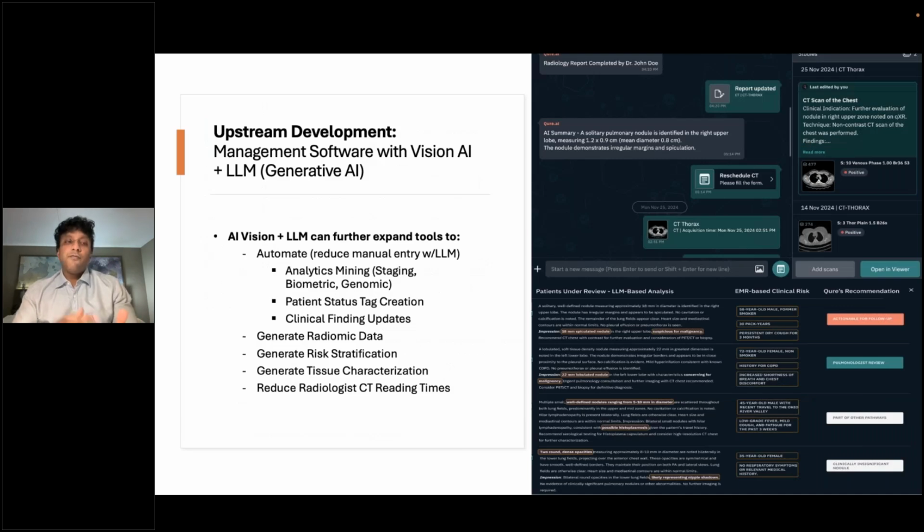And then when we take a step forward and we say, okay, what else does it do? If you look to the right, you can see what the interpretation of the deck looks like in front of a radiologist, or how it's interpreted by the large language model. But if you take a step back, what does that mean for the radiologist?